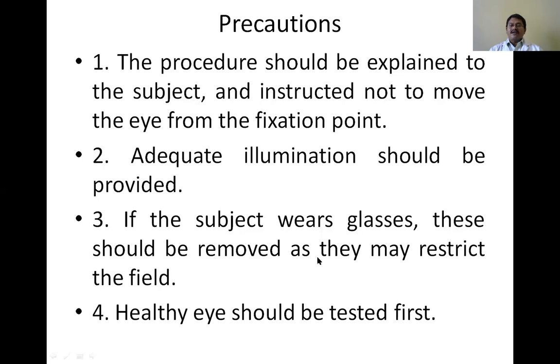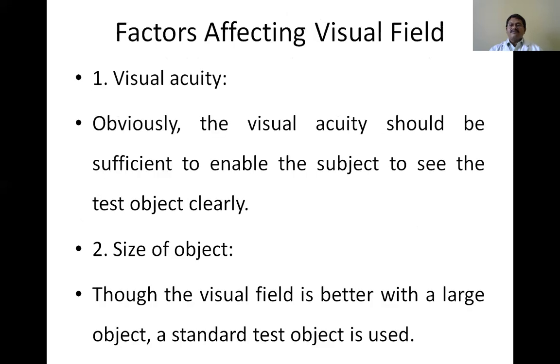If the subject is wearing glasses, these should be removed as they may restrict the field. But in the Humphrey field, where you have rim type lenses, rim free lenses will be available, which you can keep on the holder, and that is also useful in the static perimeter. So in the Humphrey field, the healthy eye should be tested first. If you test the abnormal eye first, the patient may not be comfortable. So always test the healthy eye first, followed by the other.